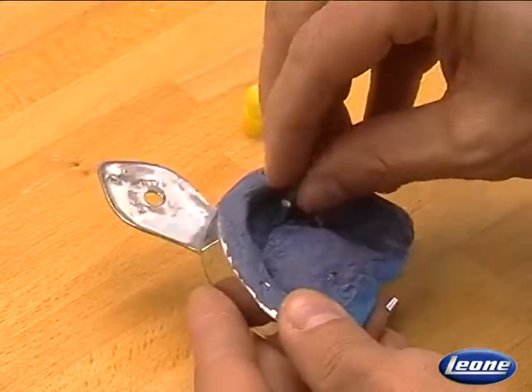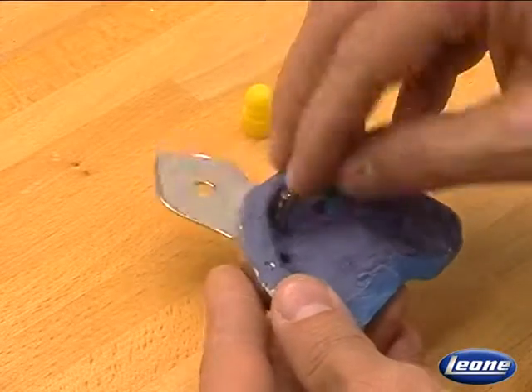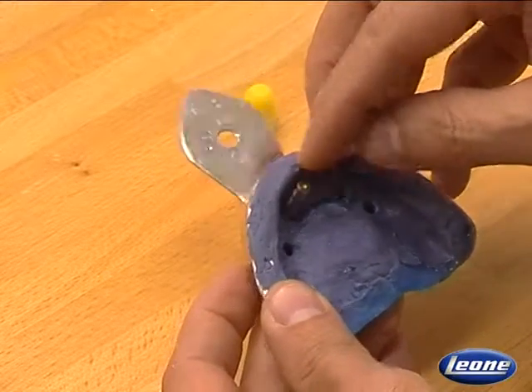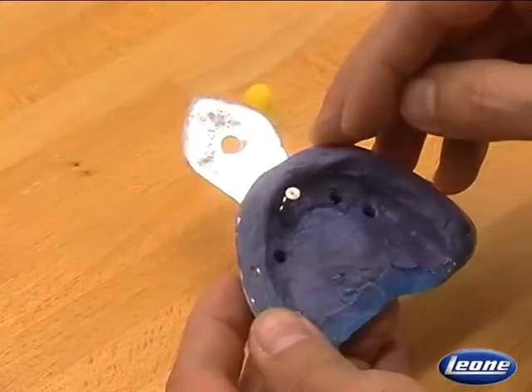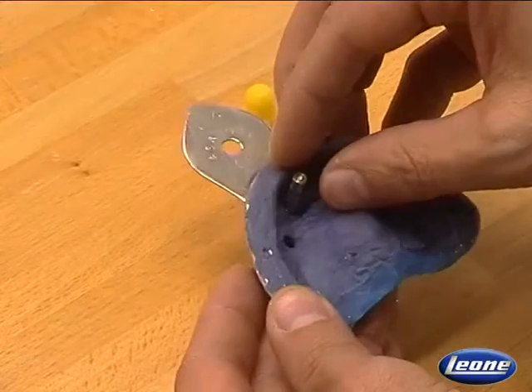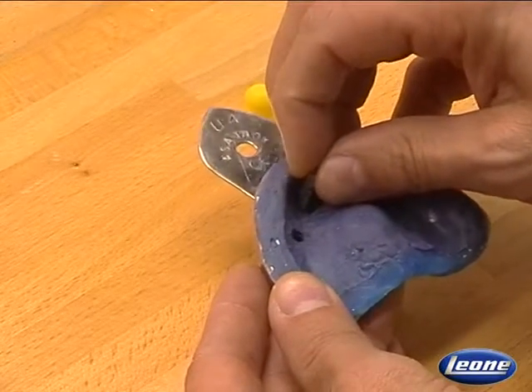Let's try it in another position. As you can see here, we do not have enough space between the impression material and the analog. Therefore, the cast would be too thin in this area. In such cases, it is much better to use an angled abutment analog.